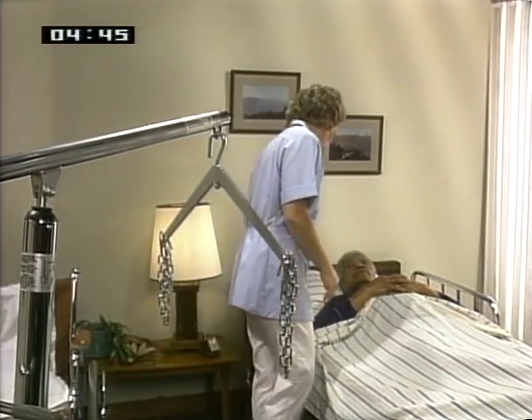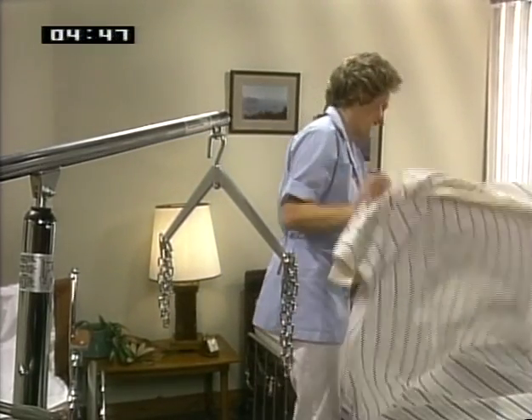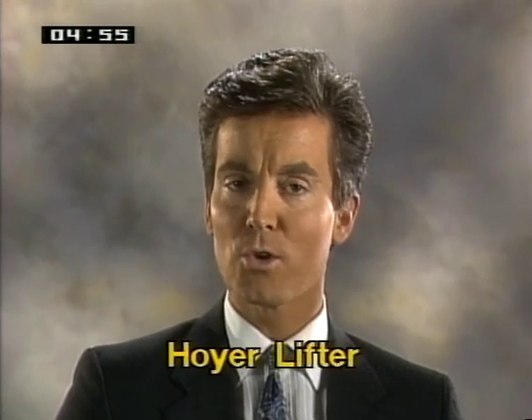Since we last visited them, Tom had a severe case of the flu, which developed into pneumonia. That, combined with his arthritis, left him in a very weakened state, unable to move independently or participate in care delivery. After being discharged from the hospital, Judy used the Hoyer lifter to transfer Tom. As he recuperated and regained strength, he was able to use a walker and wheelchair. We'll track his recovery and learn important principles that you can apply to your patients.